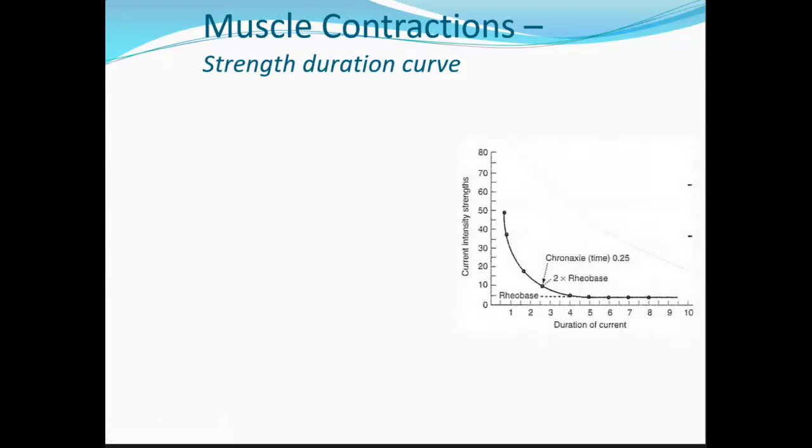So this is a strength duration curve. You have a more elaborate one, and I do too coming up, but you have the more elaborate one on page 248 in figure 12.11, which has a bunch of different lines on it. Ultimately, what you're looking at right here is how long you're going to apply a stimulus or electrical current. Down here is the duration of current, and just to make it easy, let's call it seconds, right? We're going to apply this for a certain amount of seconds. This is how high or how much we turn this up, or what the intensity is.